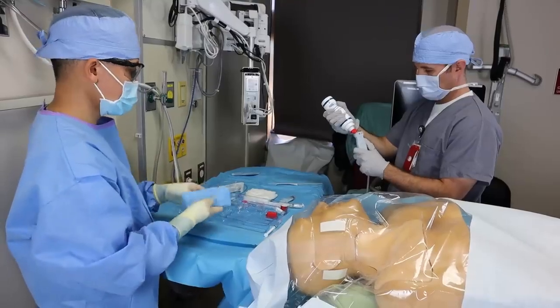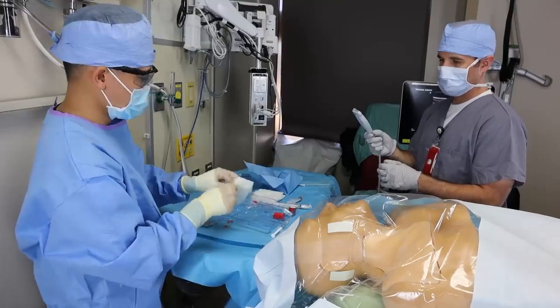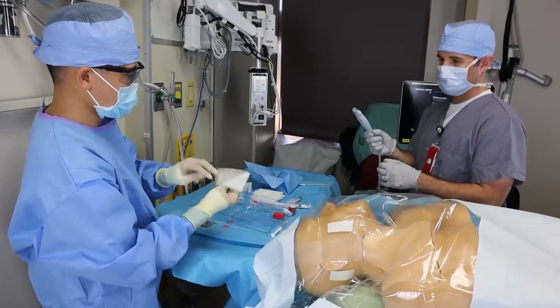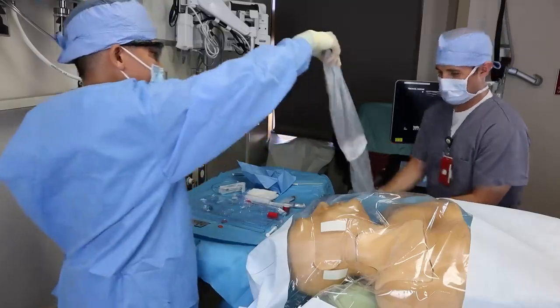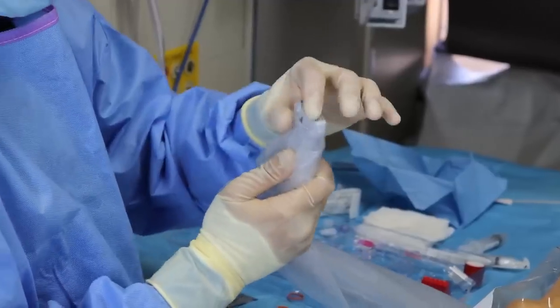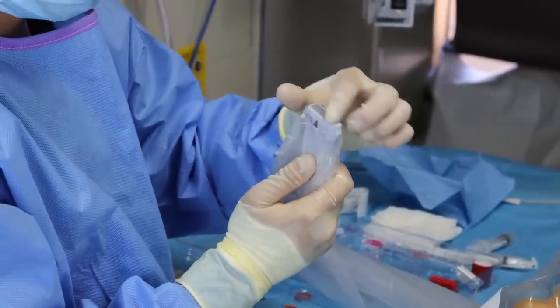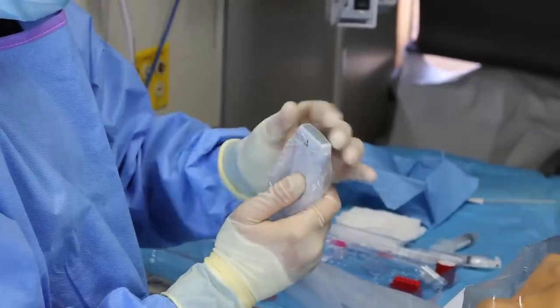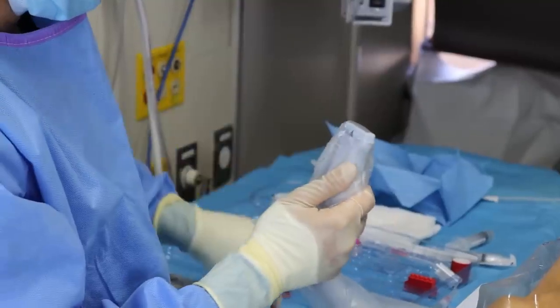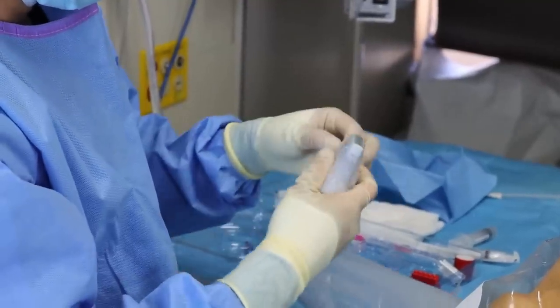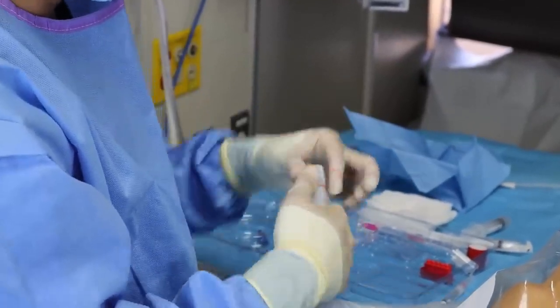Have your assistant put gel on the tip of the ultrasound probe while you ready the probe cover. Put your hand through the poochy tip of the probe cover and then reach out and grab the probe. Use your fingers to snug the probe cover up against the probe, removing any folds in the plastic. You also want to massage any air bubbles in the gel away from the tip of the probe. Remember, air is the nemesis of ultrasound. Then apply the rubber bands to secure the cover.